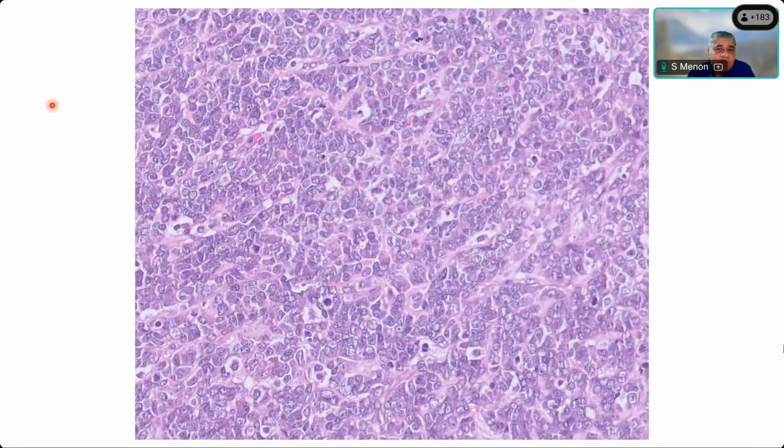But does it look high grade or low grade? Let's start looking at it. Low grade. Looks low grade. What about these mitosis? You see mitotic count, mitosis here, here. 1, 2, yes, 3. I can show you 3 in this field at least. Yes, sir. Mitosis is seen. Half of the people in the crowd are saying mitosis is seen.